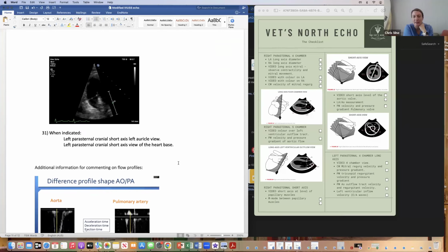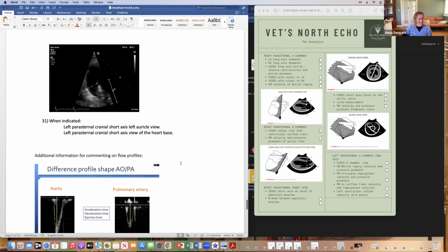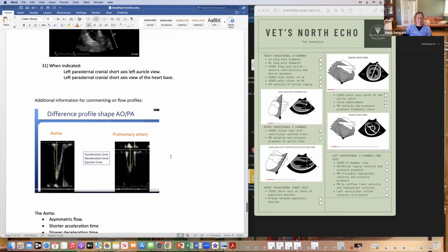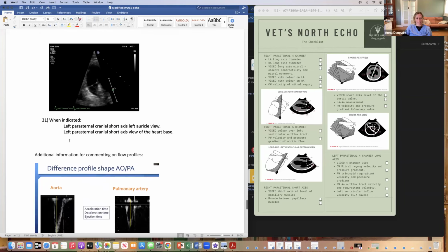And that next view, I didn't understand. I've no idea. I've never really done that one before. Yeah. Oh my word. All right. Yeah. I think we're probably going to put a big line across here and say too hard.